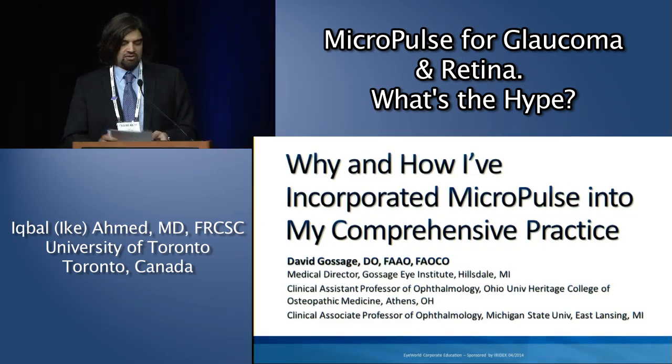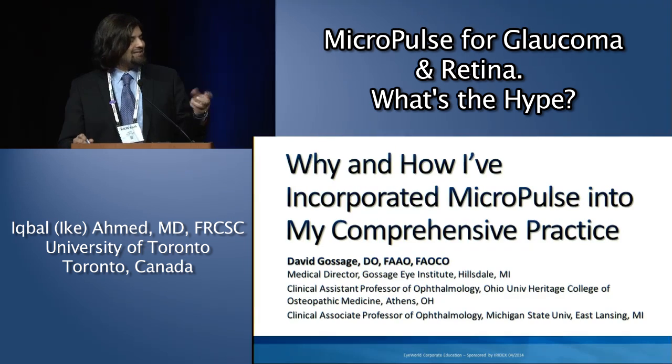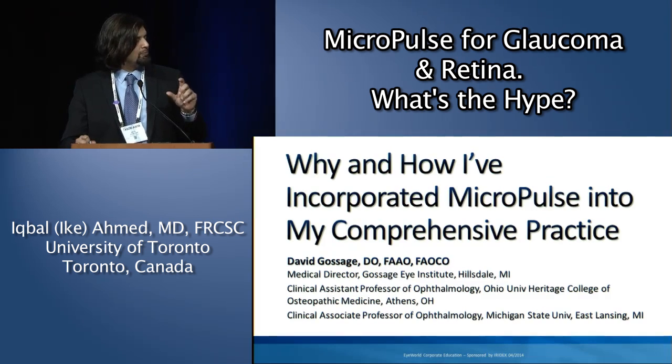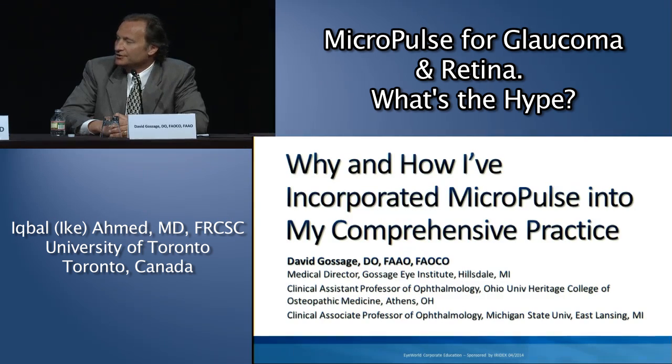What about, and this is a question that came from the audience, heavily pigmented eyes? Of course, with SLT, we will crank down that energy because of reports that we've seen with significant IOP spikes when you work at 0.8 millijoules. Any pearls for MLT in a heavily pigmented eye? Sure. I've not seen any reaction at all in the eye, whether the eye was a Caucasian with a blue iris or a very heavily dark pigmented eye. So from my standpoint, I still don't alter my treatment. I'm staying with the 1,000 milliwatts of power, 300 millisecond.